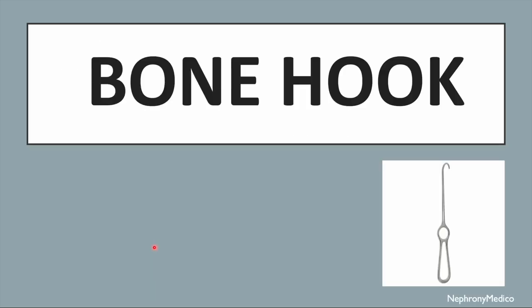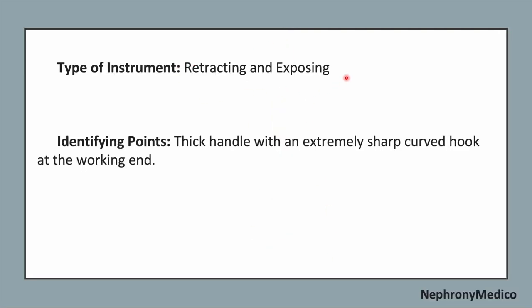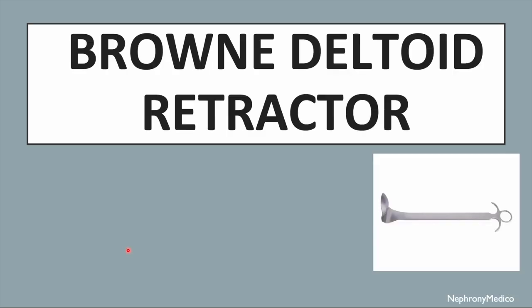Let's talk about bone hook. This is a picture showing bone hook. It is a retracting and exposing type of instrument. Identifying points: the thick handle with an extremely sharp curved hook at the working end. Use: it is used for retracting bone or heavy tissue. Important point to remember: always hand the bone hook to the surgeon with the prongs pointing downward.